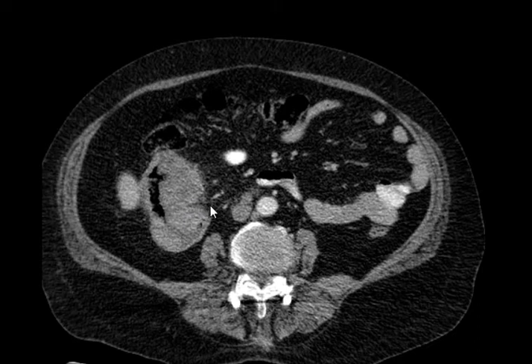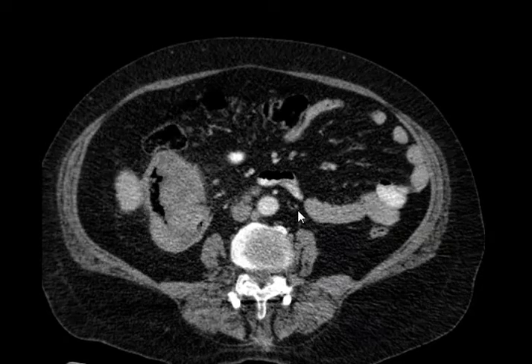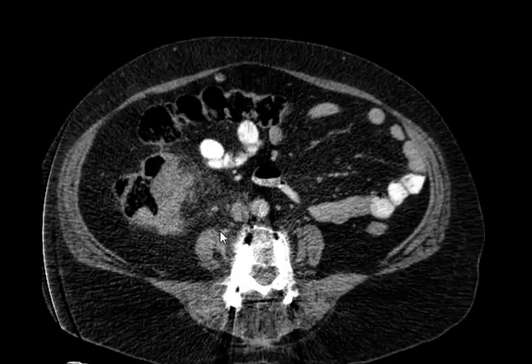So what would be your recommendation for the referring physician? Correlate with colonoscopy. You should go for colonoscopy and biopsy. And after biopsy, go for right hemicolectomy, followed by chemo, radio, those things. So this is a case of what? Carcinoma. Adenocarcinoma of the colon. Just say colon carcinoma. Everything that comes up becomes squamous, depending on your luck.